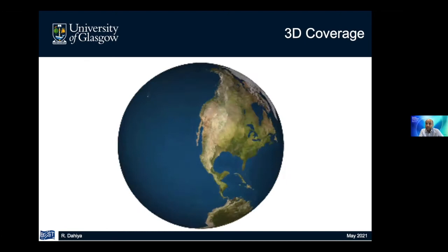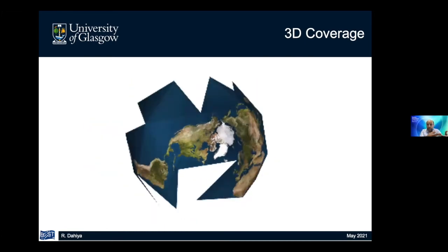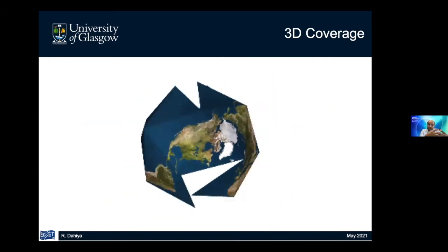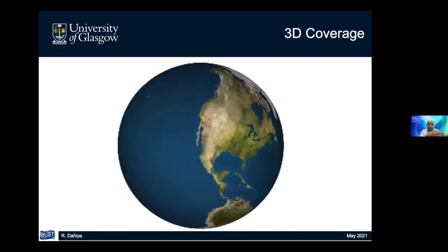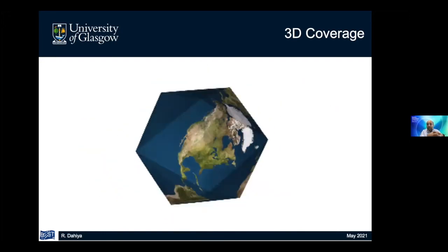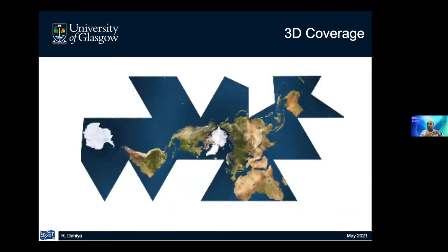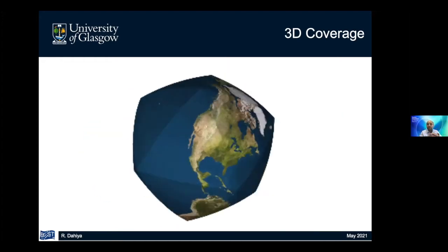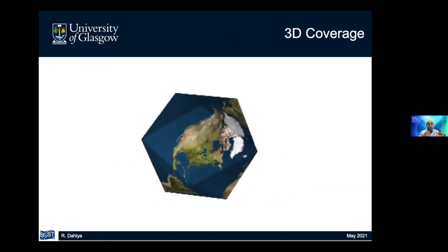It's interesting because this simple fact allows you to develop a generic solution which can be implemented on any type of robot. From the electronics viewpoint, this is also very challenging, because most of the electronic equipment that we have is good for realizing electronics on planar substrates, since they rely on techniques such as photolithography, and light travels in straight lines. So you can realize very well controlled dimensions on a planar surface, but not otherwise.